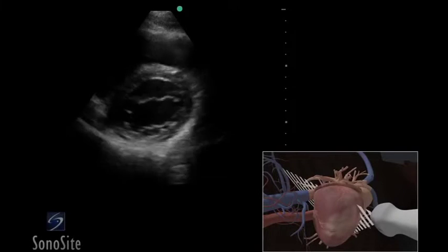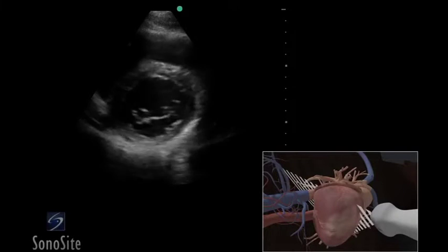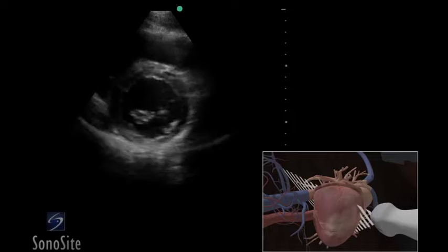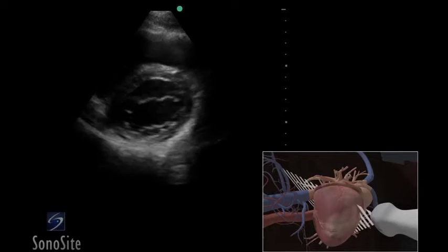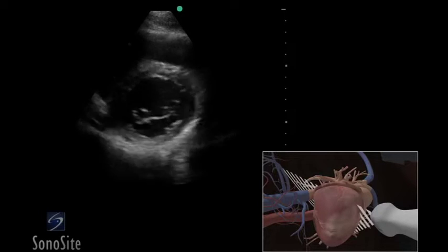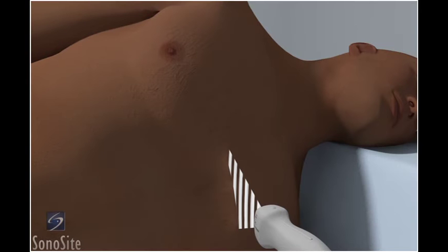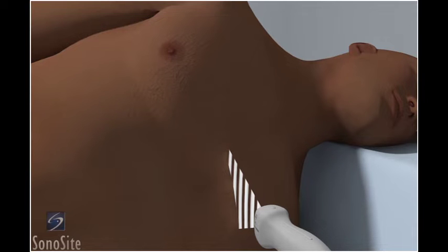A phased array transducer with a cardiac exam type is used to perform the parasternal short axis view of the heart. If possible, place the patient in a left lateral decubitus position to reduce any lung artifact and to bring the heart closer to the anterior chest wall.